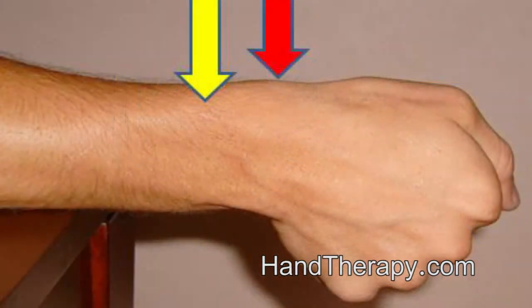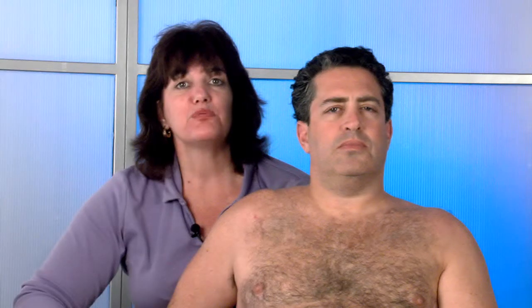Now if we look at the hand, the red arrow is going to show you DeQuervain's where the yellow arrow is showing you intersection syndrome. Sometimes being that close together, you will have to position the arm or the wrist in the appropriate exposure of the targeted tissue, and in this case it would be ulnar deviation.